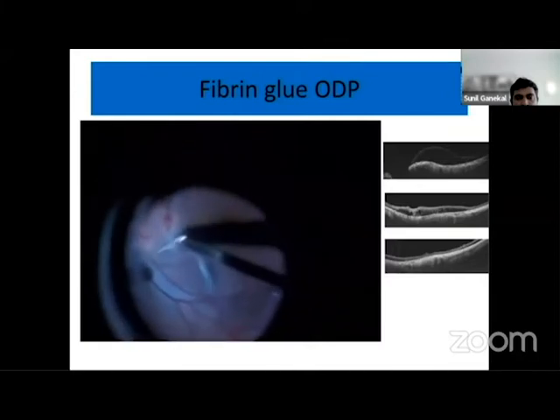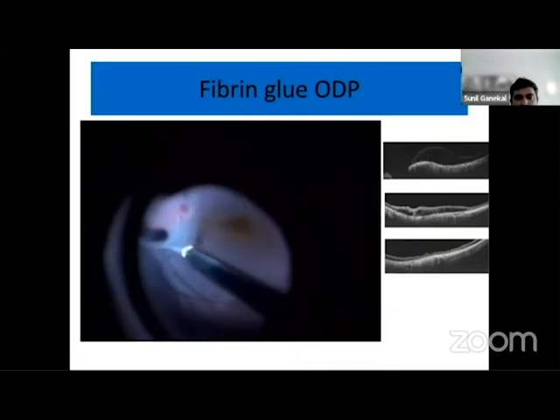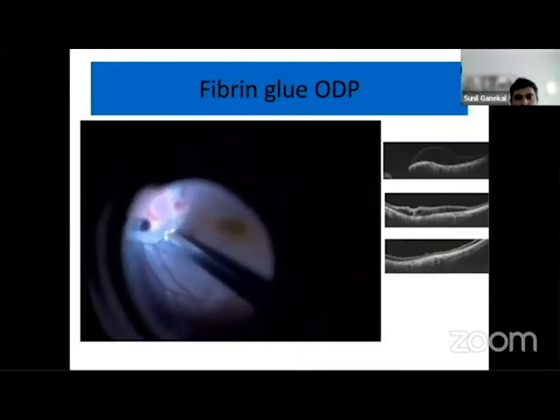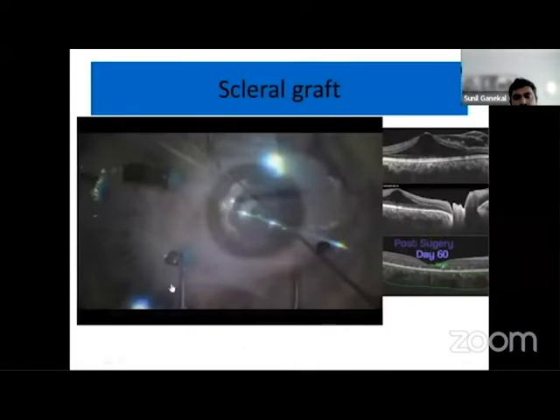You need to remove that coagulum, the fibrinous membrane, from the retinal surface, lift it up and trim it as much as needed to the area of the optic disc margin. So it acts as a sealant for the closure of the optic disc pit. It is an additional maneuver you can consider in a patient with optic disc pit maculopathy.